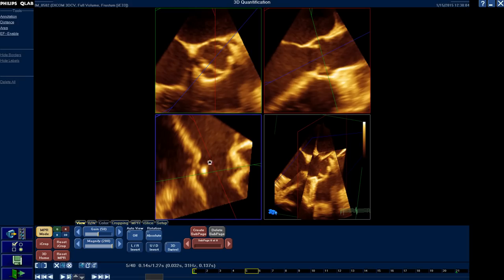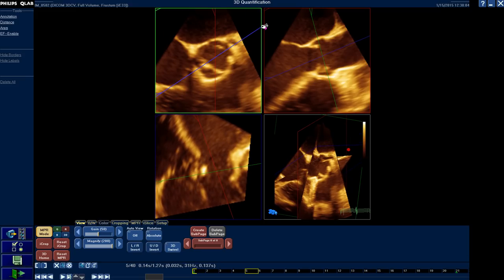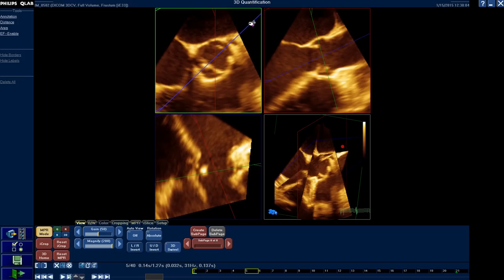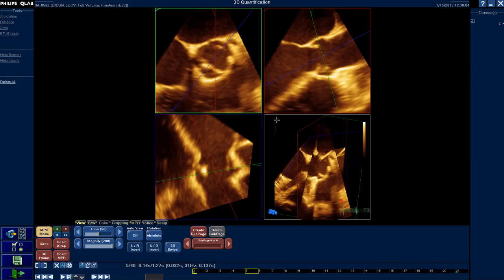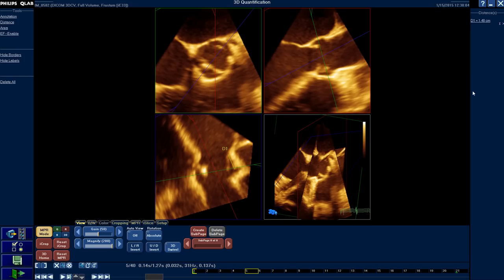Look at the image here — this is the annulus, and this is the ostium of the left main. If I move this line away from the left main, I can't see the left main origin. Just moving this line towards the left main, I open the left main ostium here. So I have a very clear view of the annulus together with the left main, and I can measure the distance from the annulus to the ostium of the left main, which is here about 14.8 millimeters. This distance is very crucial for patients undergoing TAVI, for example.